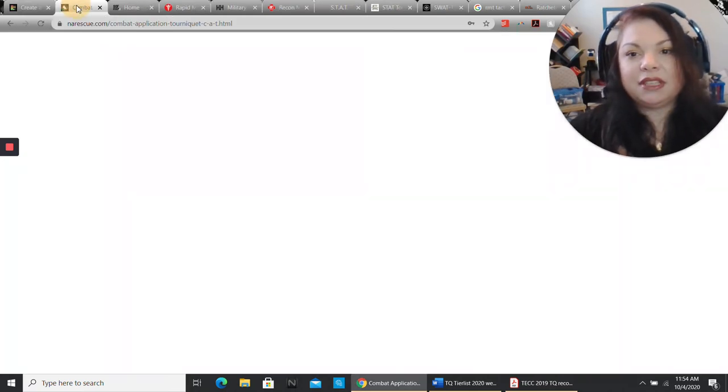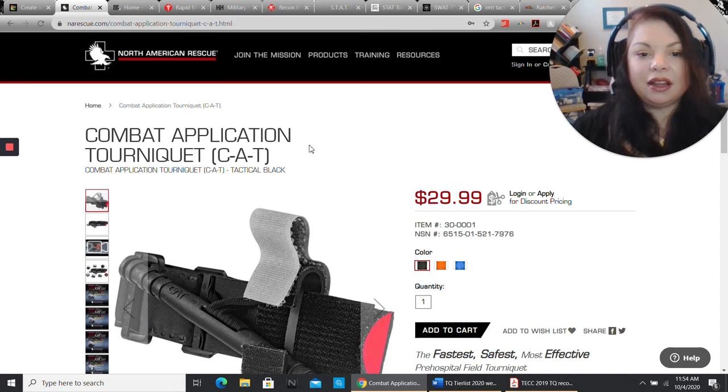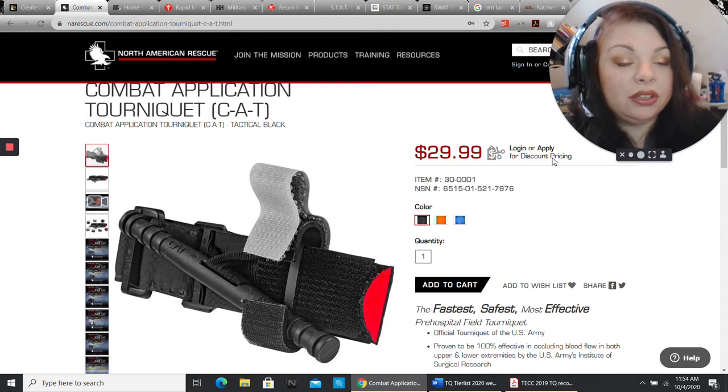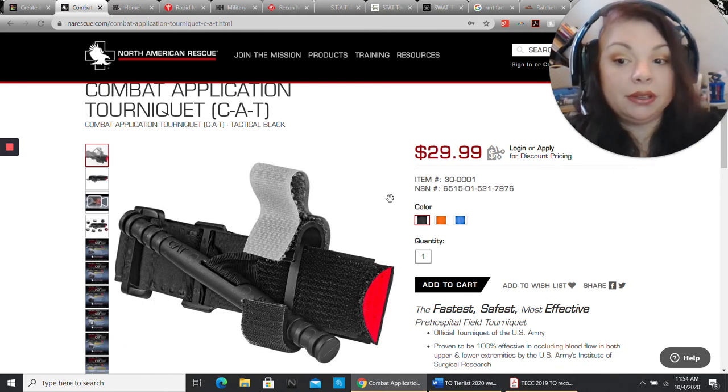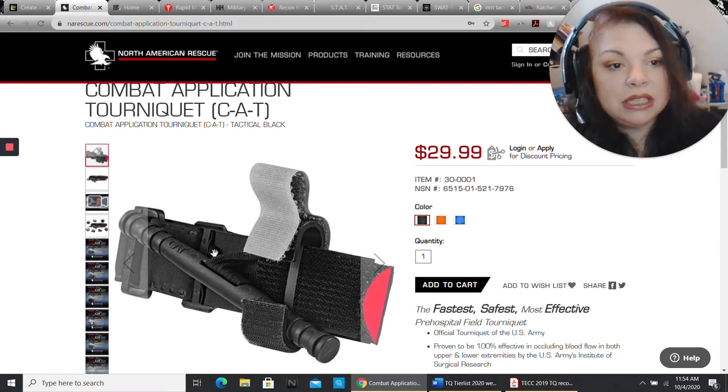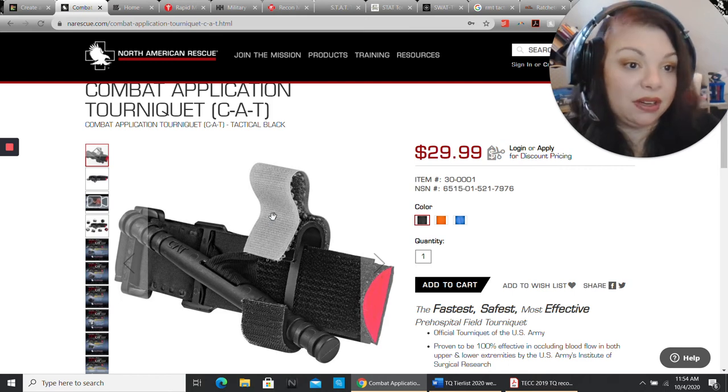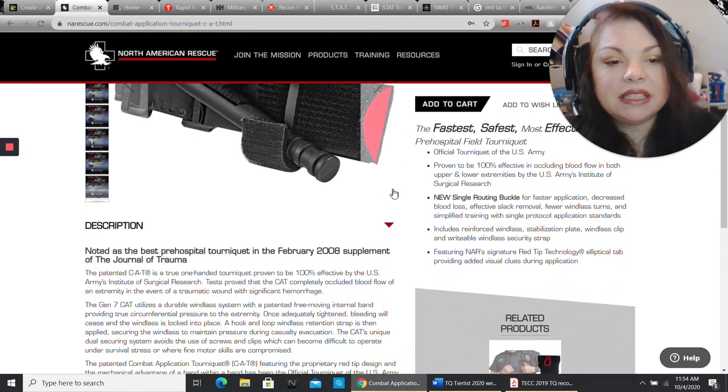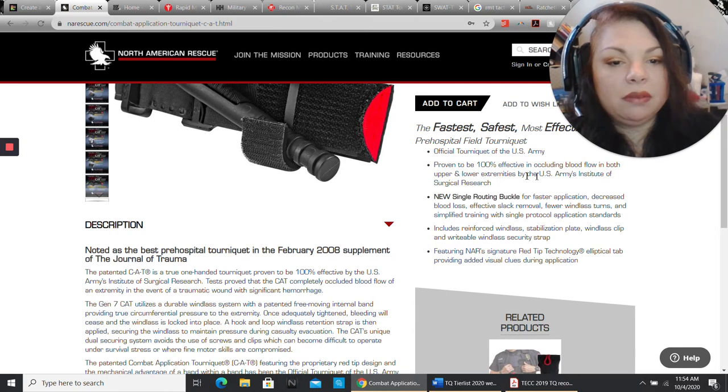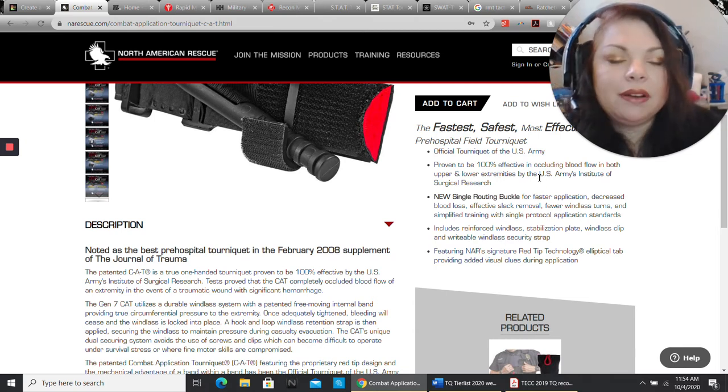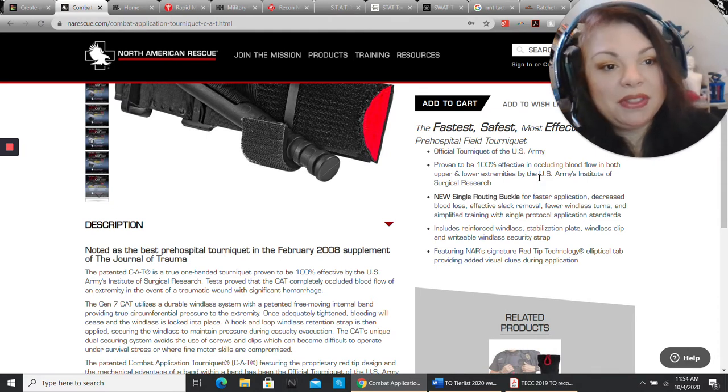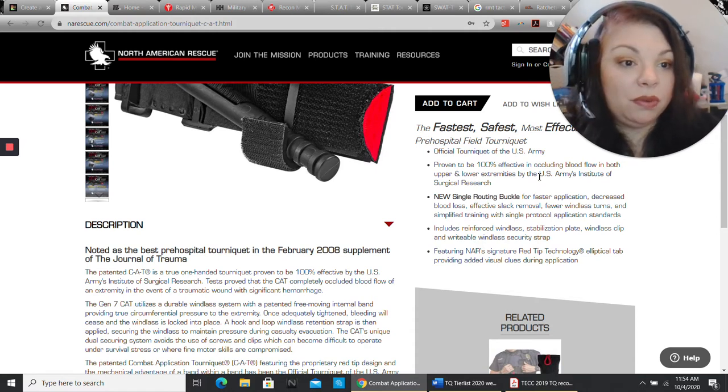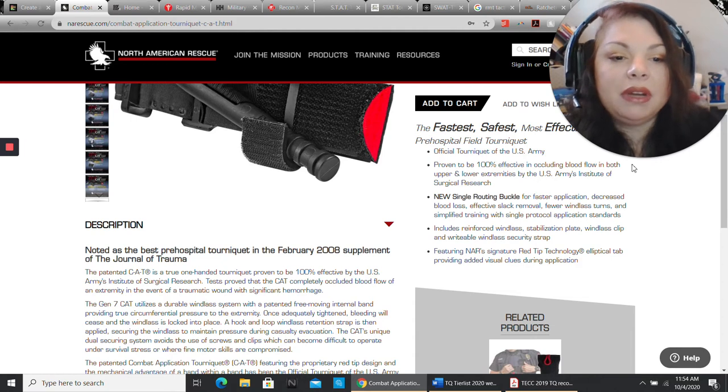That is the CAT, the Combat Application Tourniquet. We'll pop on over to their website. It's fairly affordable, $29.99. They do bulk pricing, so if you're with an agency, you can get a really good deal on this. It is recommended with the current COTECC guidelines. It is constantly evolving. We're now on Gen 7 of this. It's the official tourniquet of the U.S. Army. Proven to be 100% effective in occluding blood flow. I've seen the NAVSEA report.